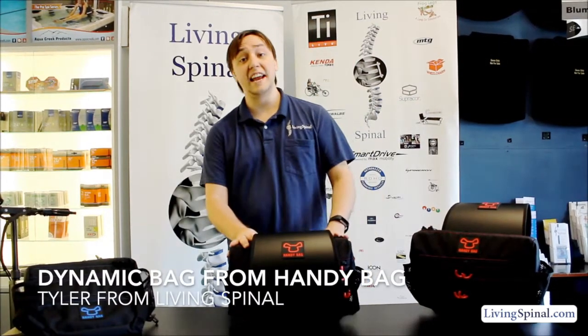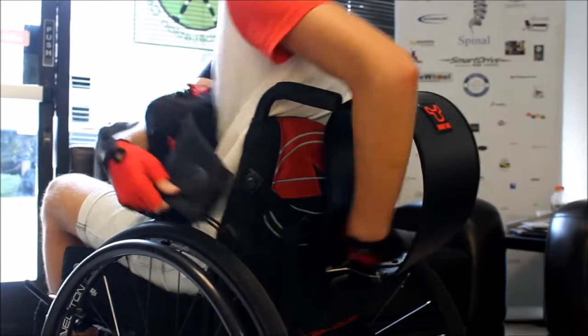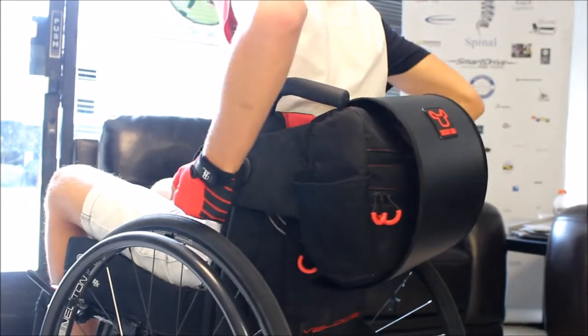Hey everyone, Tyler here with Living Spinal, and today I will be presenting you with the Dynamic Handy Bag. The Handy Bag is a nice little wheelchair backpack that goes on the back of your chair. It comes in a nice little hard case that stays on the back of your chair, and the bag is fitted nicely inside.